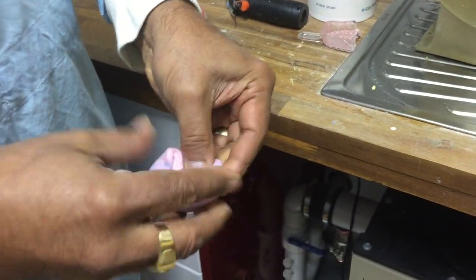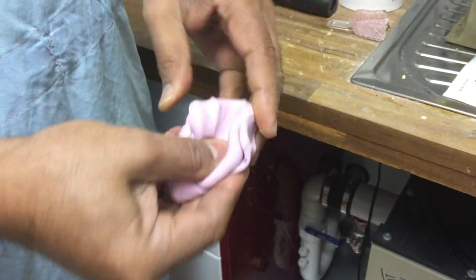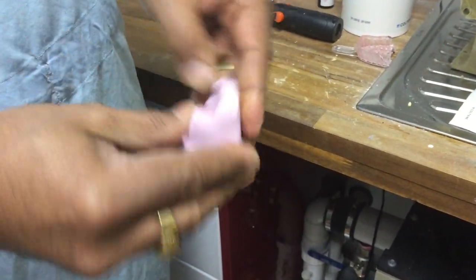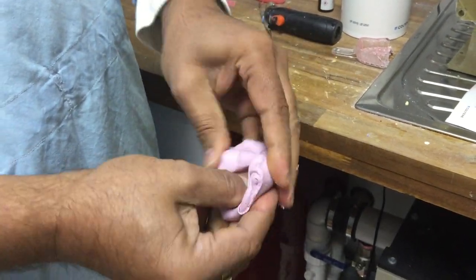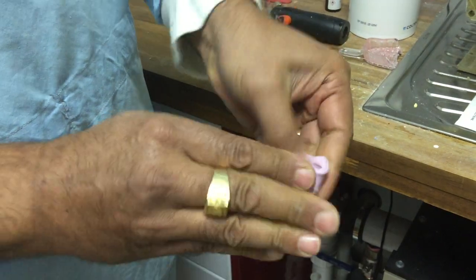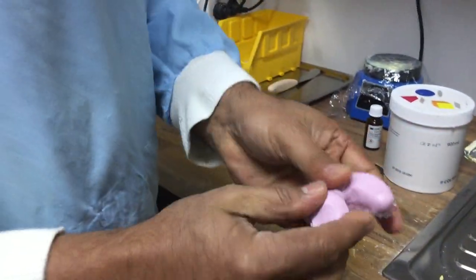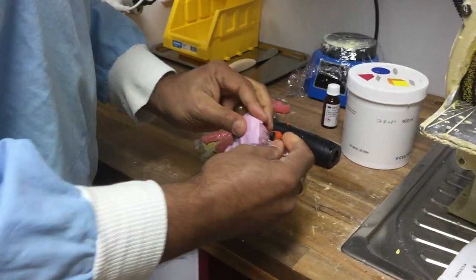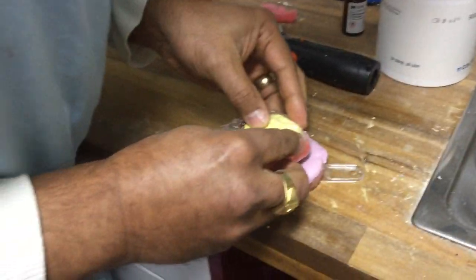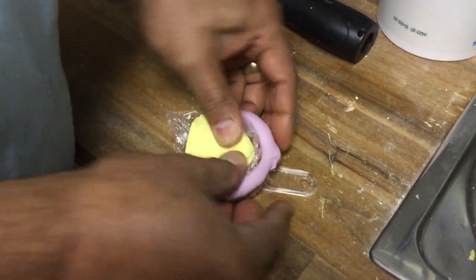Then I fold and squeeze. You need to make sure you get all of the streaks out and that the material is mixed in well — the accelerator causes the putty to set. You should do this fairly quickly. Once there are very little streaks and it's all mixed evenly, I roll it into a ball and then into a sausage, and I lay it out and give it a little squeeze.